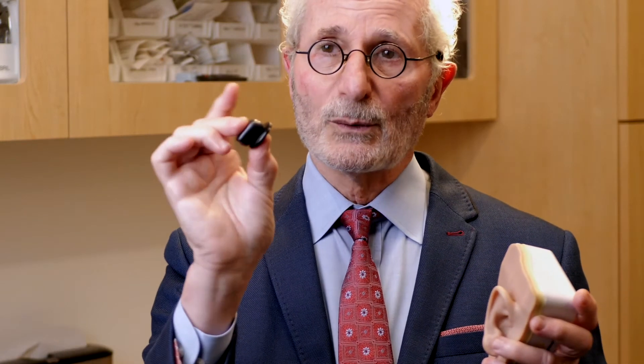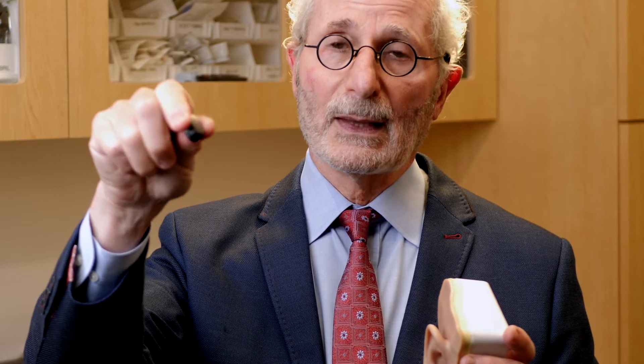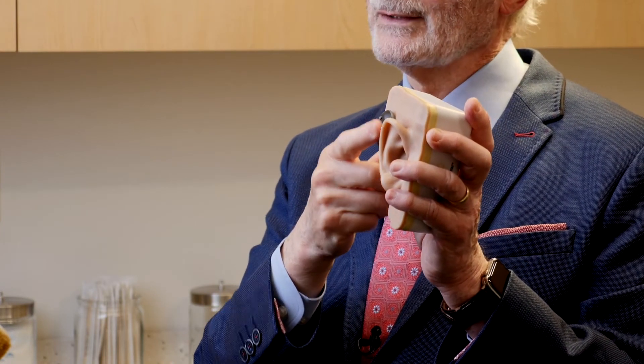This also has the issue of feedback, and the newest bone-conducting hearing aid is something called the Osia. It's made by the same company that makes the Baha. This has three components: the battery, the microphone, and the vibrator. The Osia has no external vibrator — the vibrator is separate and inside — and therefore you can touch it and wear a hat and don't get feedback.